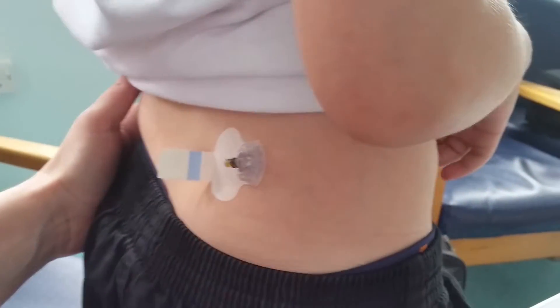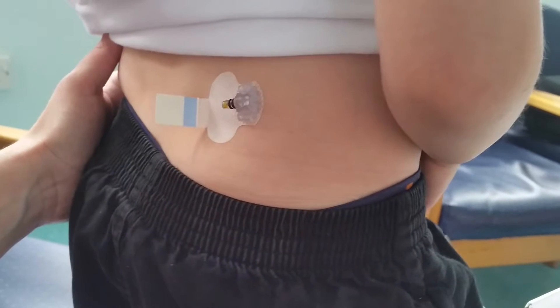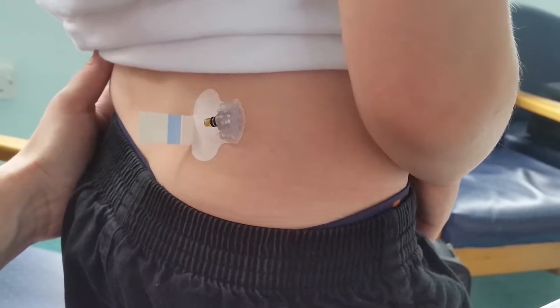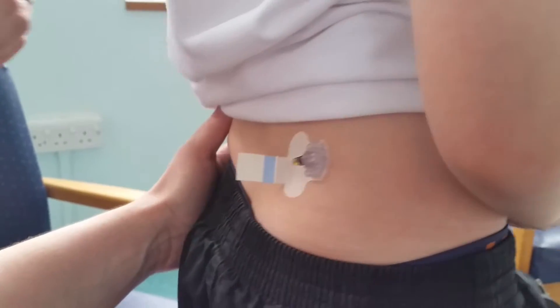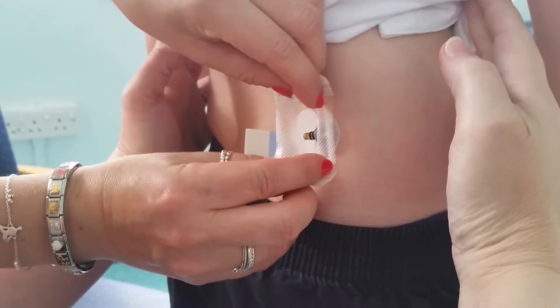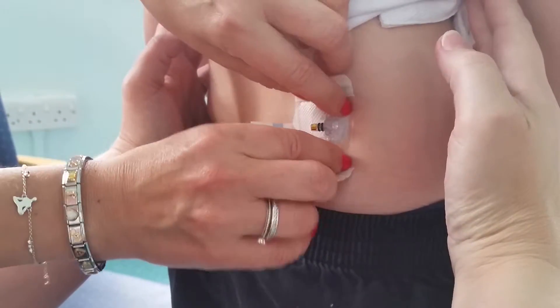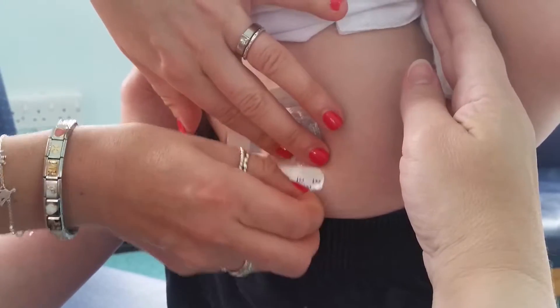The sticky, as you can see, comes with a hole in it. I'm just going to take number one — the numbered bits of plastic face the front — and I'm just going to put it over the front part of the sensor. Right, just secured it into place.